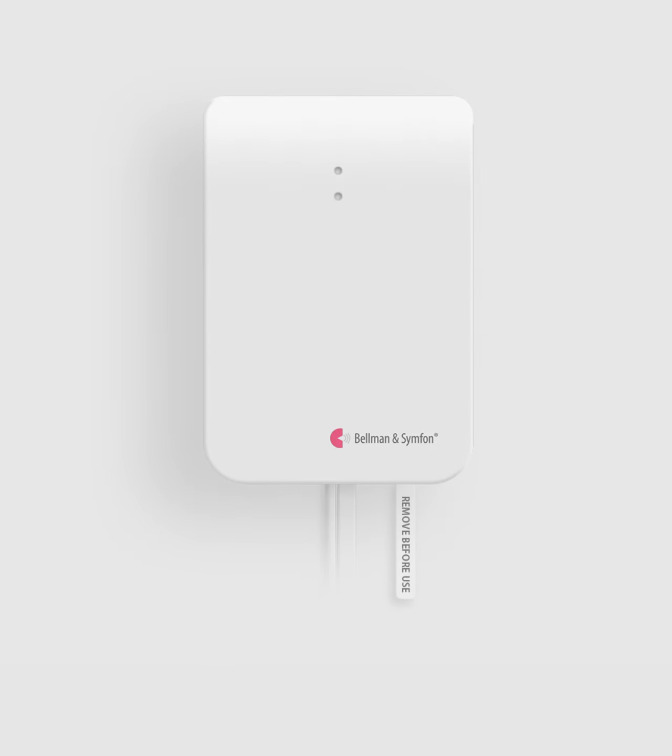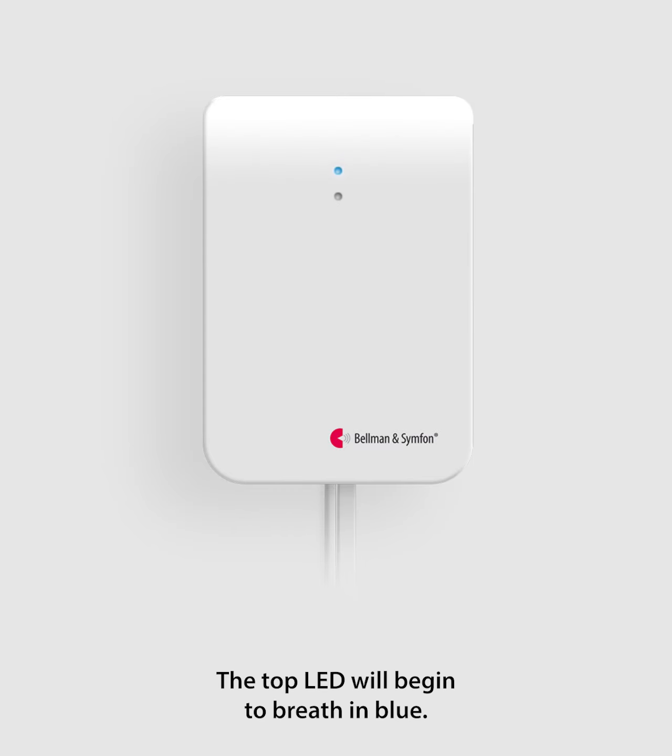Let's get started. Unpack the bridge and remove the battery tab to start it. The top LED will begin to breathe in blue.